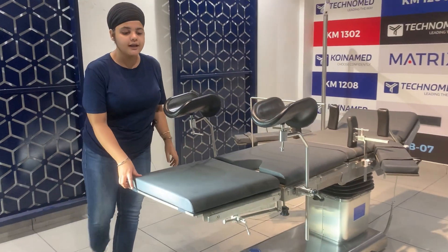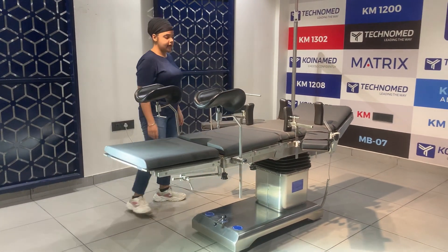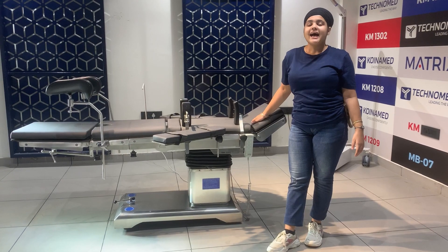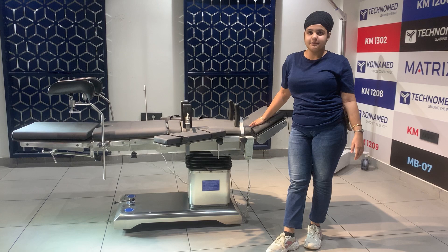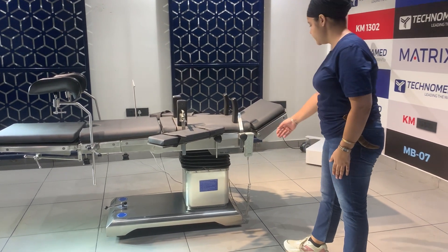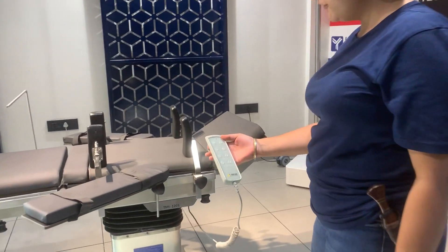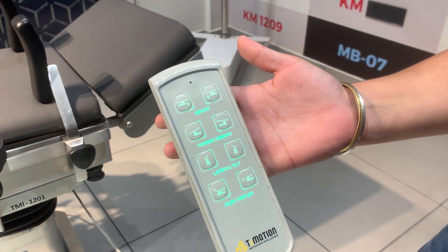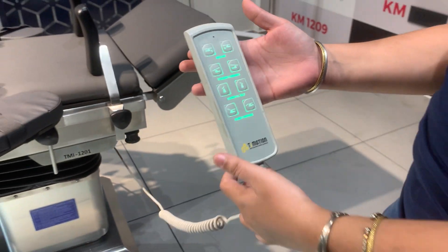The total length of the tabletop is 2000 mm and the width is 520 mm. As this is an electric operation table, I will operate the positions with the help of a hand remote. This remote has an LED backlight system for easy operation.